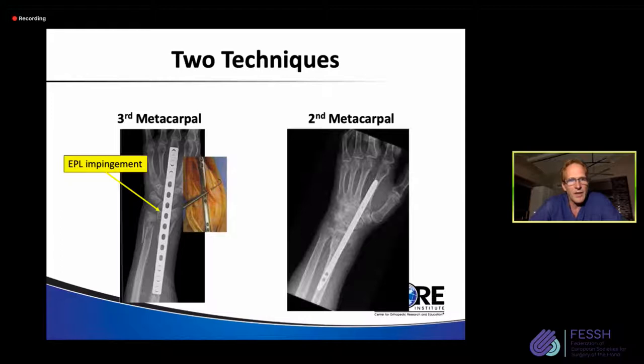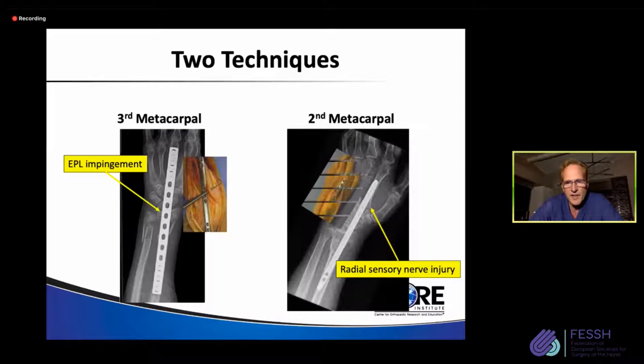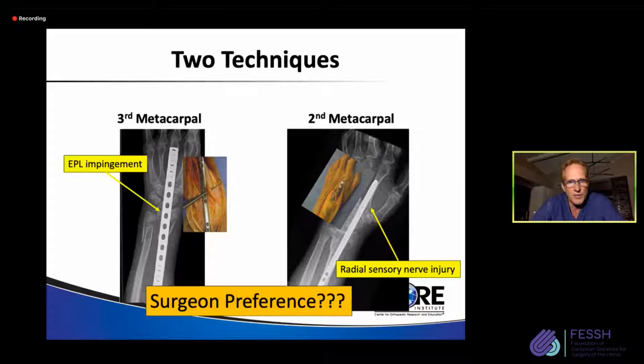The third metacarpal has the obvious problem of EPL impingement, and we're going to talk about that a little bit later in more detail. The second metacarpal span puts the radial sensory nerve at risk with making that incision there, and that can certainly happen as well. So most surgeons, even in North America, if you were to give them the choice between the third and the second metacarpal, may choose one or the other depending on which complication they would like to deal with. But the reality is that it's really not surgeon preference. It's really dictated by the type of fractures you want to fix. And we're going to talk about that a little bit more in detail now.